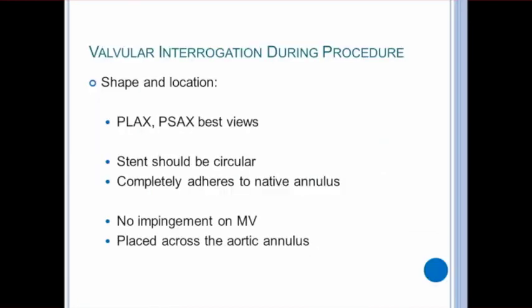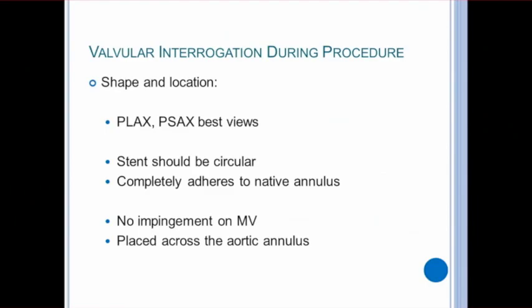The sonographer should interrogate the shape and location of the aortic valve using the parasternal long and short axis views. Looking at the shape of the stent, it should be completely circular and the circumference of the stent should be fully opposed to the annulus. If it's not completely circular or if there is space between the stent and the aortic annulus, the valve may be undersized, which may not treat the patient's aortic stenosis, or the valve may not be fully expanded, leading to potential paravalvular leaks. To evaluate valve placement, look for any impingement on the mitral valve or if it's above the aortic annulus. If any of these situations occur, there is an increased risk for the valve to migrate either down into the left ventricle or up through the aorta.